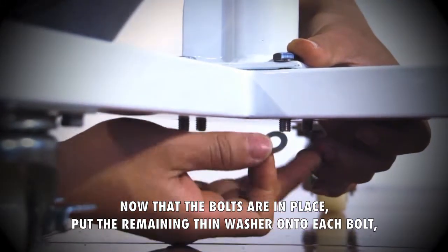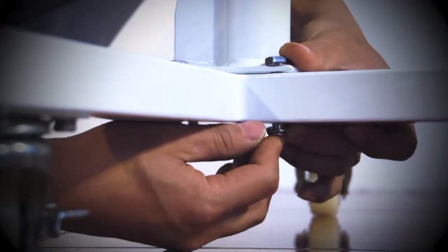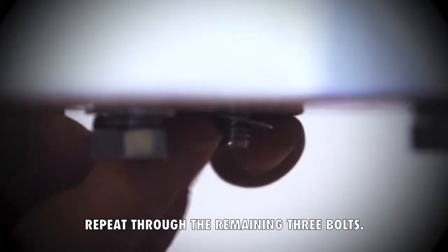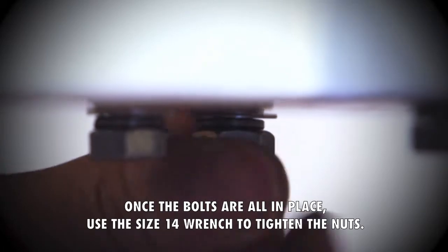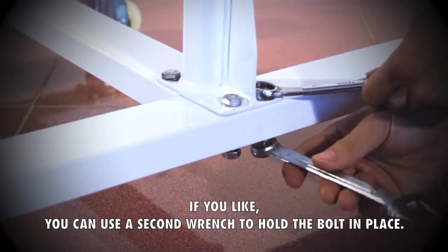Now that the bolts are in place, put the remaining thin washer onto each bolt, followed by the spring washer. Finally, screw the nut onto the bolt. Repeat for the remaining three bolts. Once the bolts are all in place, use the size 14 wrench to tighten the nuts. If you like, you can use a second wrench to hold the bolt in place.